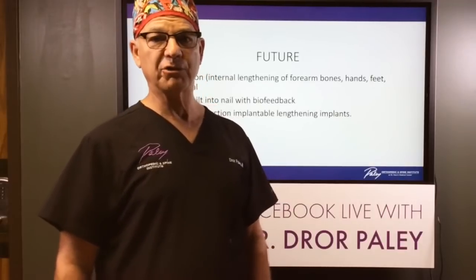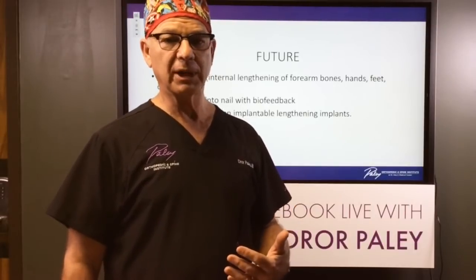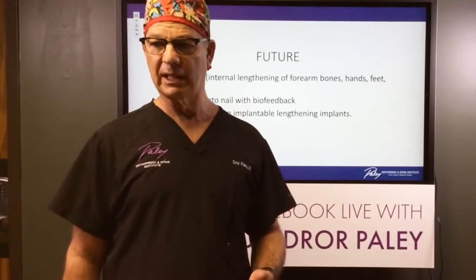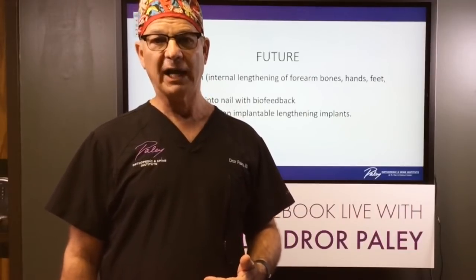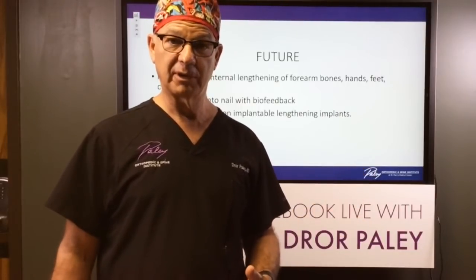And like I said, in very young children, the diameter of the bone is too small, but you can use a device that fits on the outside of the bone, like a plate or an extramedullary rod. While in older children, there's enough room for the rods, even in pseudoachondroplasia. Is the internal device less painful than the external?